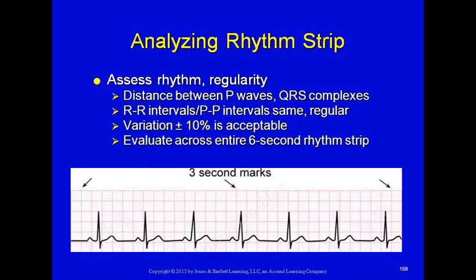Now, when I'm analyzing the heart rate, there are methodical steps that I take. Even though I may look at a rhythm and say, that looks like this arrhythmia, I need to be really careful when doing that. You should take an approach when you're looking at rhythms so that you look at certain things each and every time and answer certain questions before identifying or interpreting the rhythm.